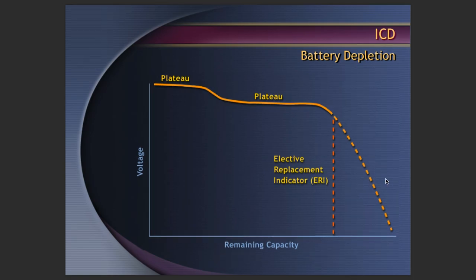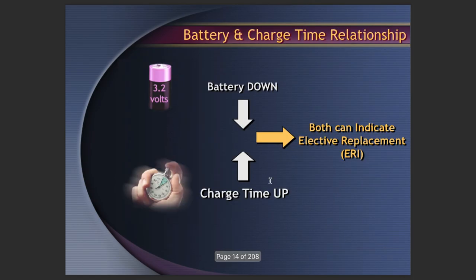So yes, it does have a battery. With the passage of time, it starts to come down. This is what is called the phenomenon of battery depletion. So how does it go? A lot of times we also have to see when the battery should be replaced, in fact.